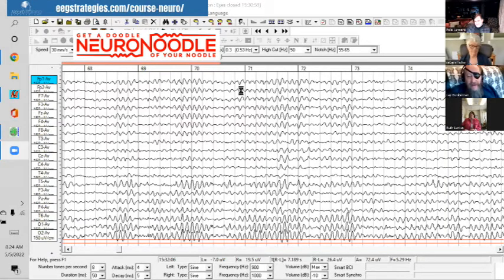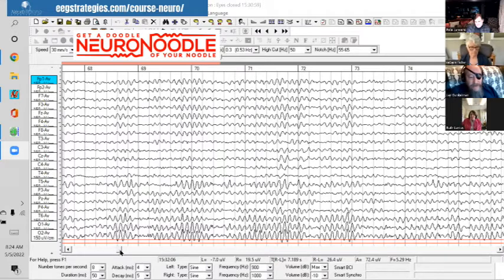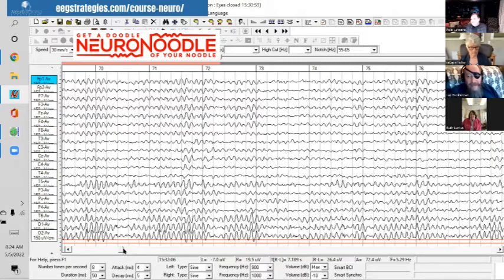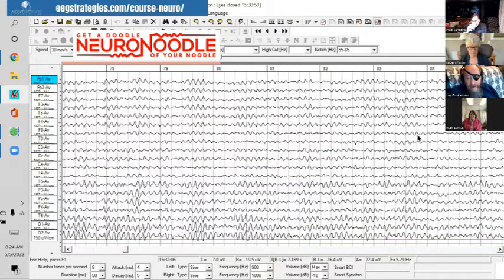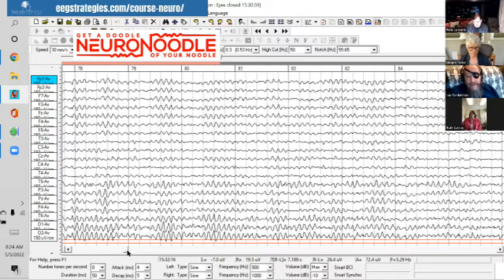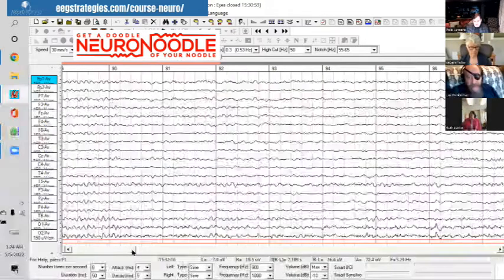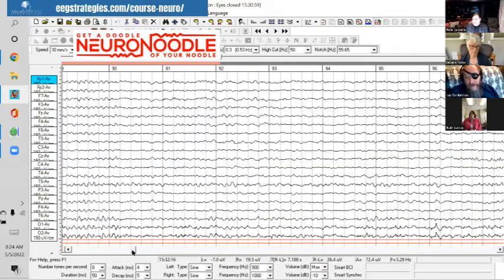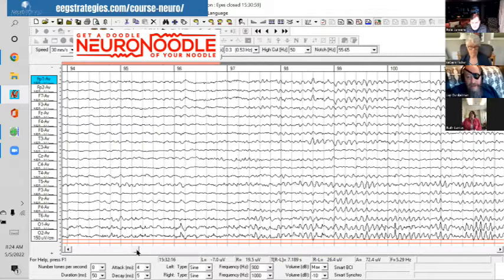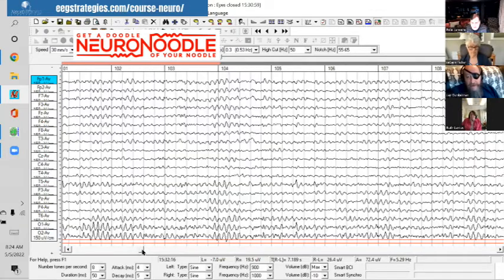This is an eyes-closed EEG full of alpha, and there's an excess of coherence in the alpha up front. You can see the alpha all lines up in phase. There's phase shift at the back of the head where there's some function, but the affective regulation and attentional regulation up front is just idled out. You can have this pattern with lots of different presentations, just with simple depression.